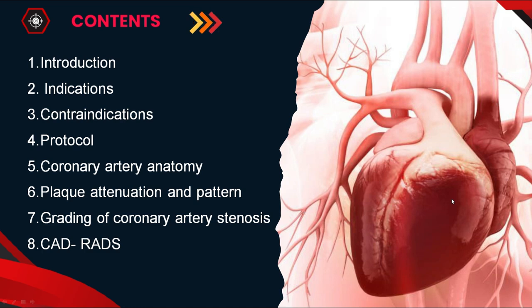Coming on to CT coronary angiography, coronary artery disease is the number one leading cause of morbidity and mortality worldwide. CT coronary angiography is a non-invasive technique to detect coronary artery disease by injecting the contrast medium into the vessels.